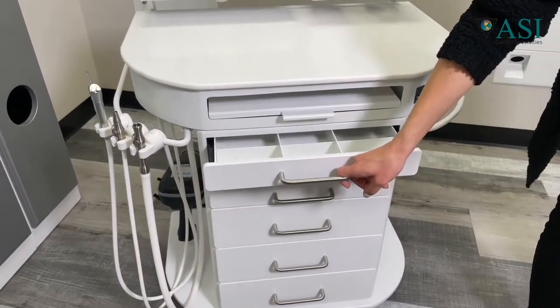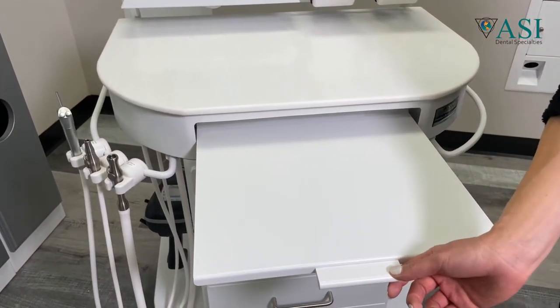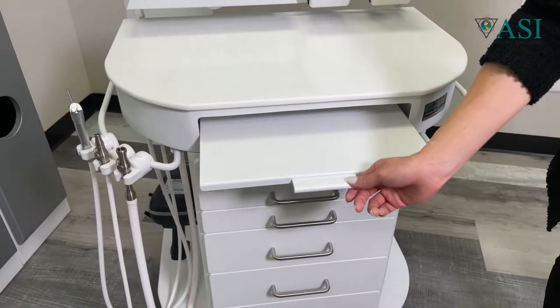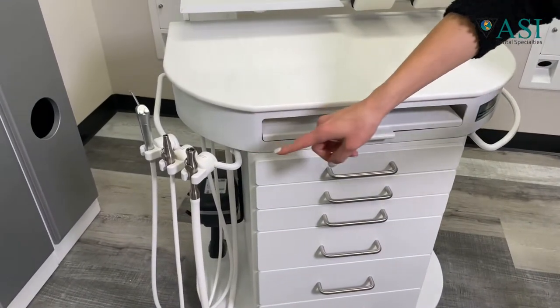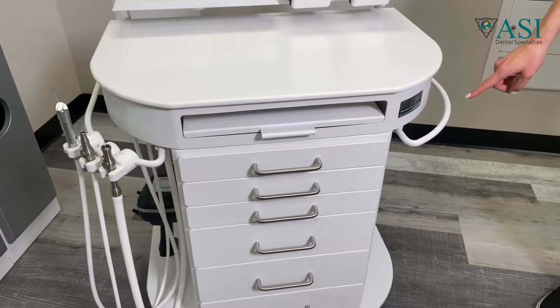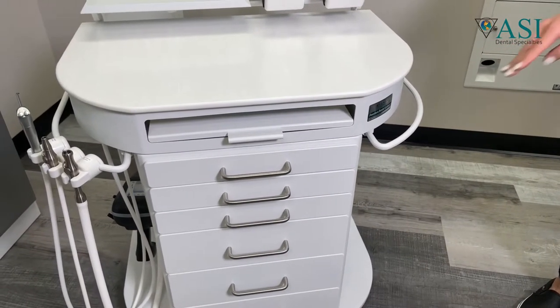It also features a sliding work top that can be used as a keyboard drawer or to place instruments. This cart is double-sided, so you can use one side for instruments or a dual set for ambidextrous use. If the assistant wants accessory items on the unit, you can place them on the other side.